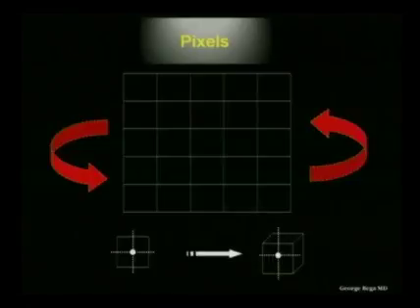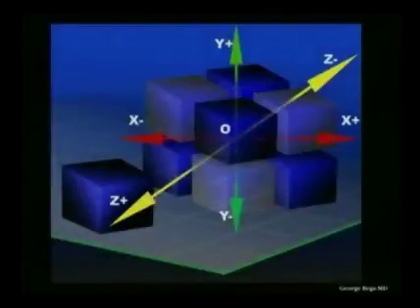The pixel information is put into a volume matrix, and in this volume, each one of these voxels will represent a specific point in the anatomy. In the background of this information, typically there is an X, Y, Z coordinate system that will quantify the position of every single one of these voxels. This is very important for quantification purposes because for the first time with 3D ultrasound, we can accurately quantify volumes.